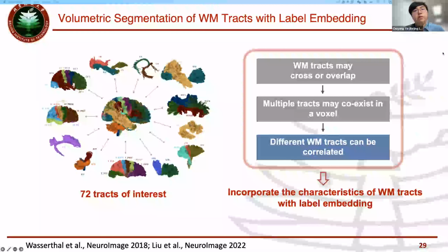Also, our group has improved this TractSeg strategy with some other ideas. Because some tracts, like the fornix or anterior commissure, are very thin, and the uncinate fasciculus has a very curved structure, the segmentation of these tracts can still be challenging with the TractSeg algorithm. We try to improve the segmentation quality for these challenging tracts.